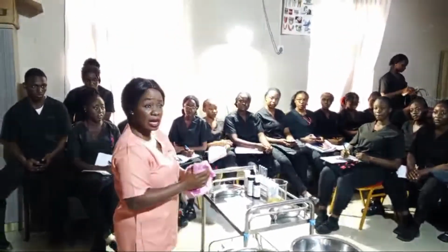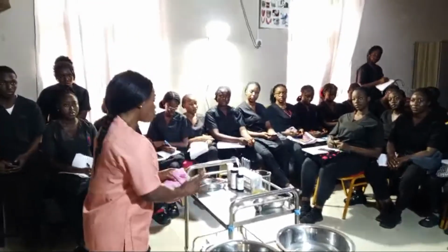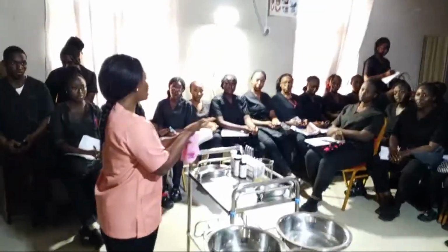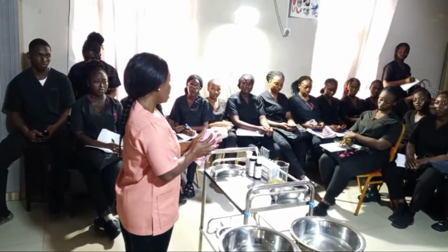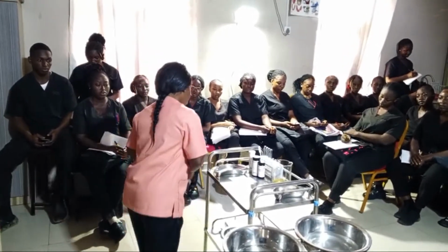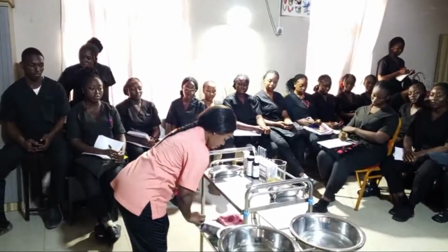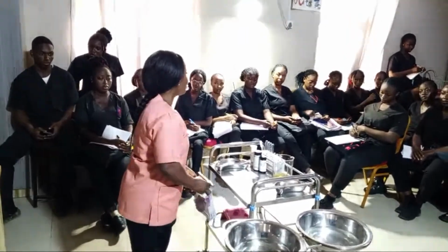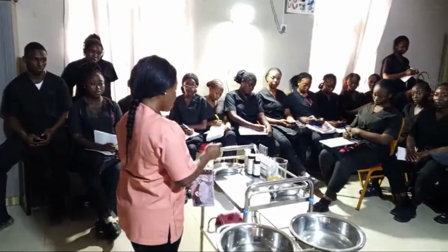You know, during exams, there are some students who will be struggling with gloves because they do not dry their hands, because the glove will be sticking to their hands. So it is important that you dry your hands properly, and then you put on your glove. So remember, this procedure is a clean procedure, not a sterile procedure. So I'm going to use latex glove.